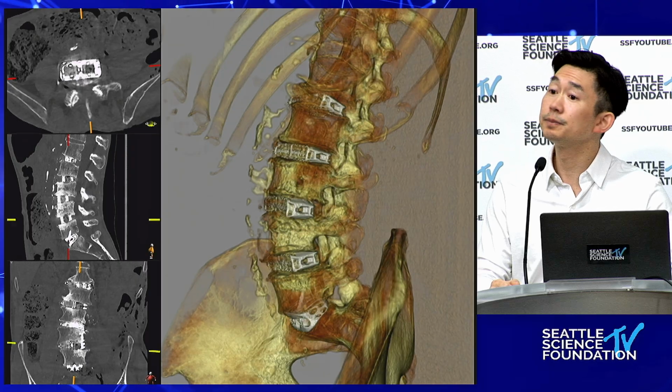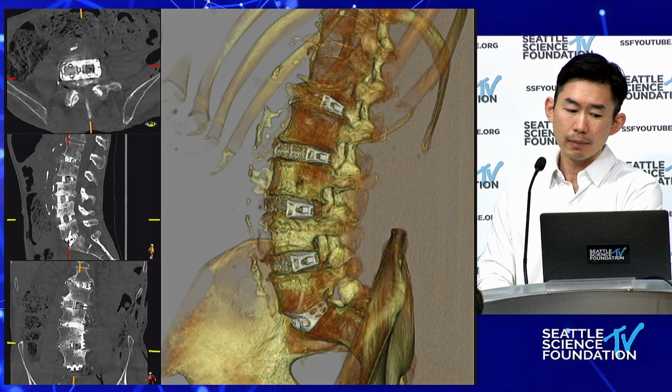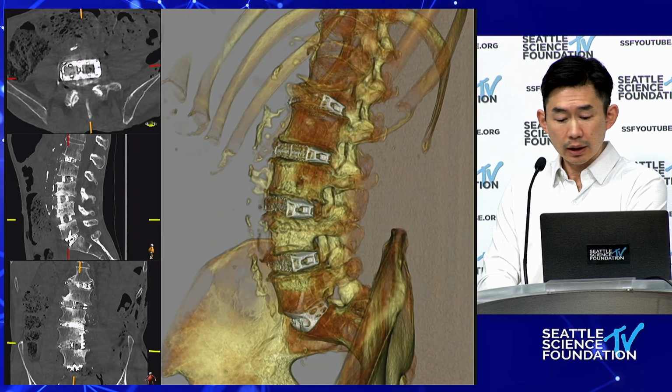All right, if that's helpful. Yeah, Zach, just a comment on the coronally tapered cages. They created a really nice coronal correction. Do you have any tips on the best usage for those coronal tapers?